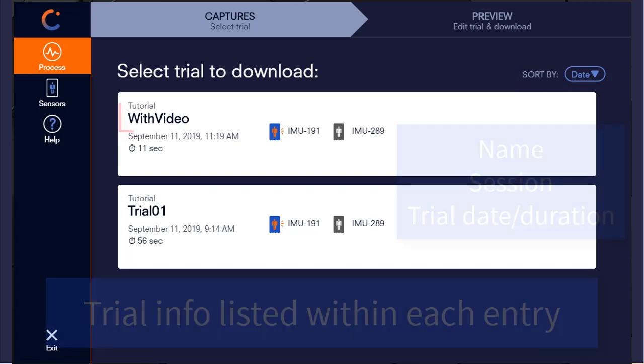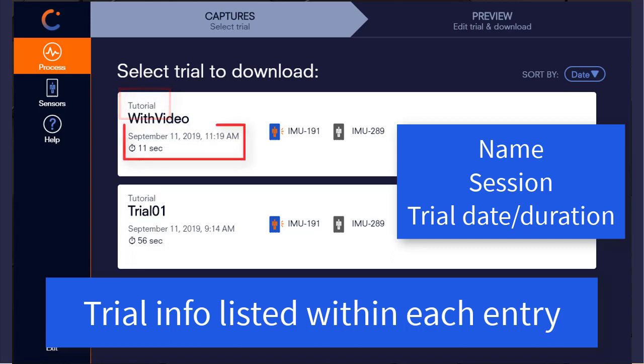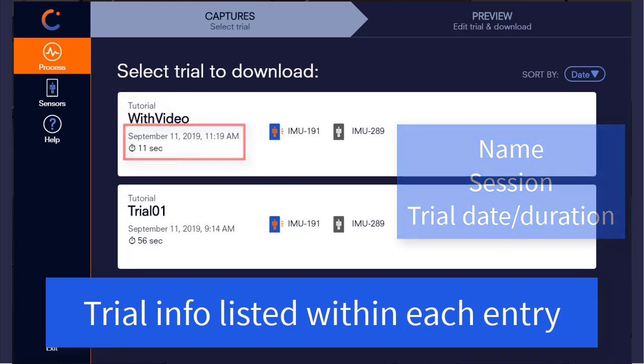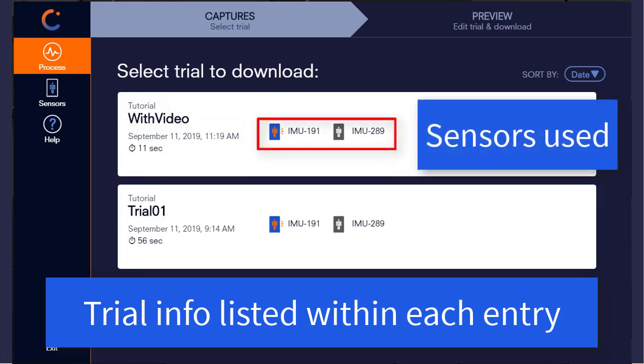Each trial will display its name, session, details about date collected and trial duration, as well as the sensors that were used during the capture of that trial.